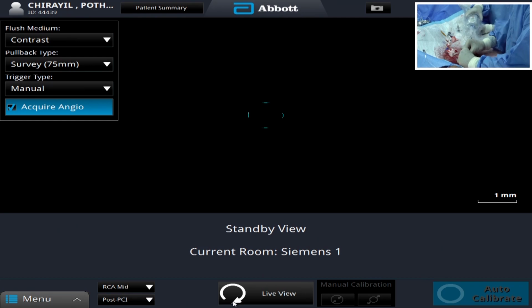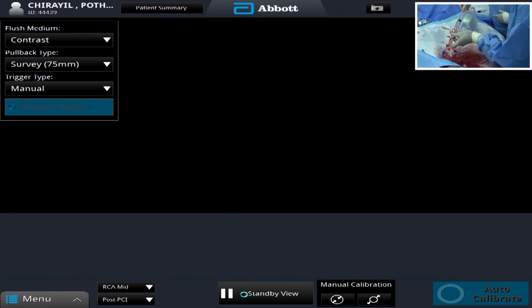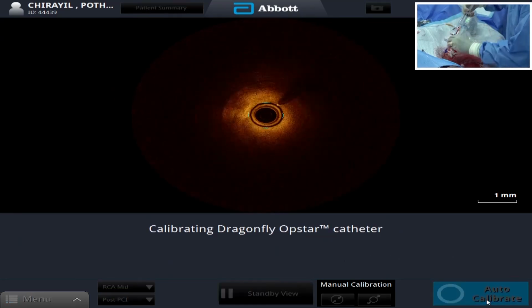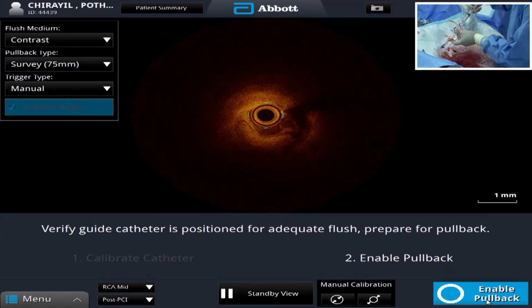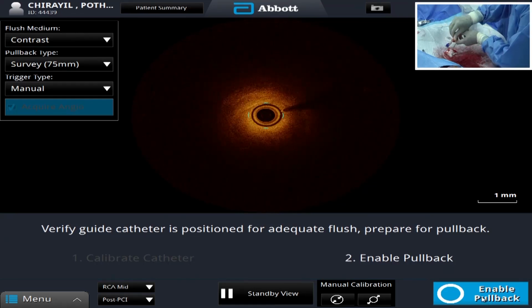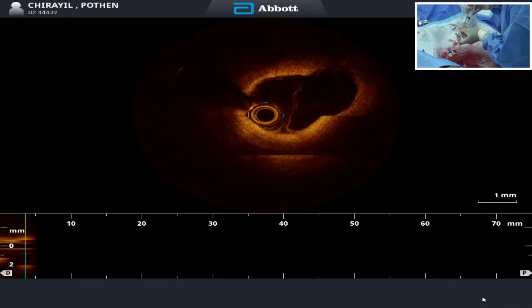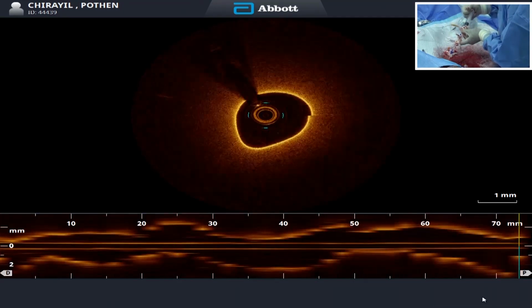We are almost ready here. Okay, ready? Yes. Activate.